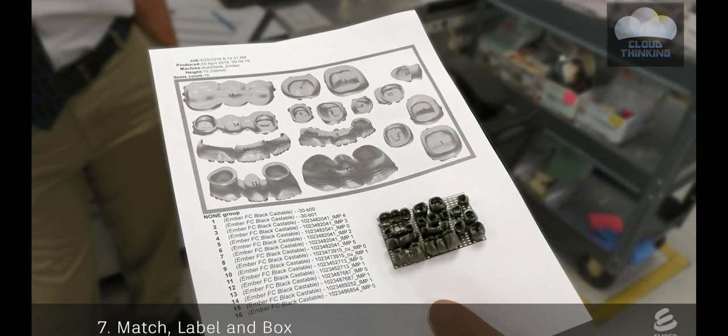Because the print can have multiple crowns from multiple patients, they create a sheet for each print. The sheet has an image that matches each crown and coping on the print with a specific patient. For example, the image labels crowns number one, two, and three, which match these crowns on the print and these cases for a patient.